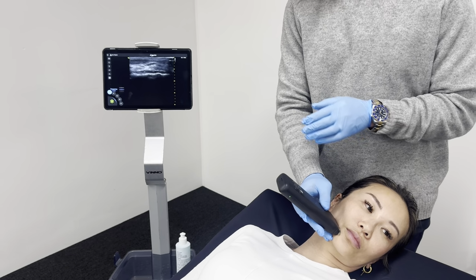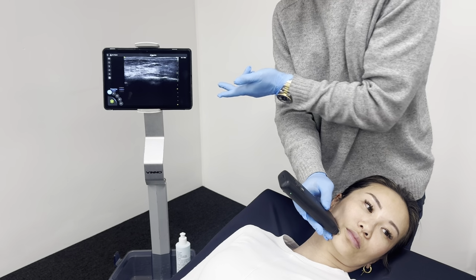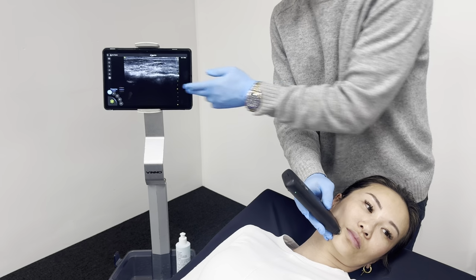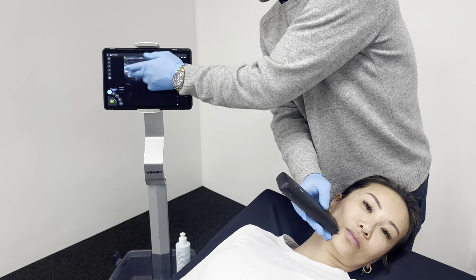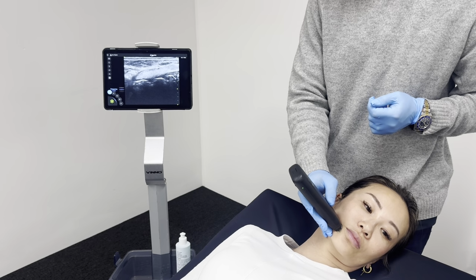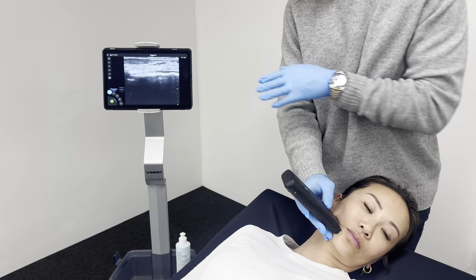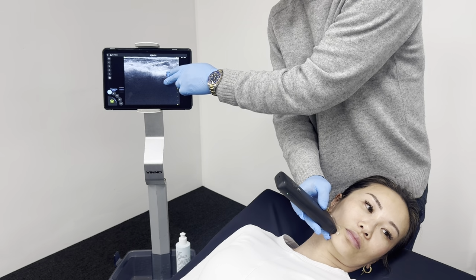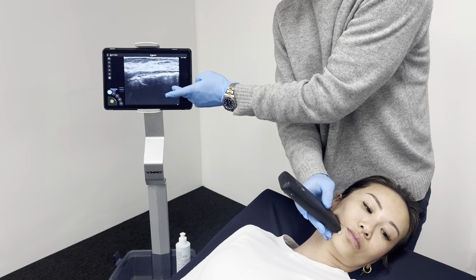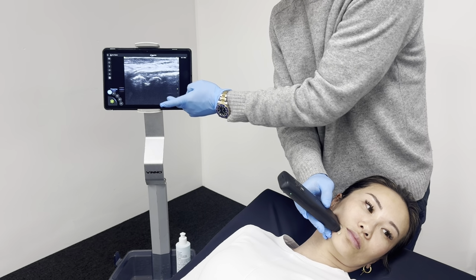So the first thing we're going to do is change the depth, and we do that just by swiping on the touch screen, so we make it a little bit less deep. And then the next thing I'm going to do is increase the gain. I do that just by swiping up on the left hand side of the ultrasound image. So now I can see at the very bottom of the screen either the mandible, the white bone if we're down towards the bottom here, or if I bring it up a little bit higher, I can actually see the curvy white teeth.